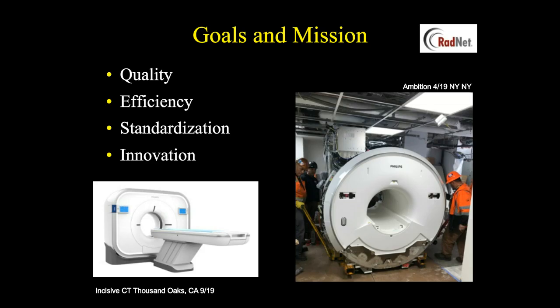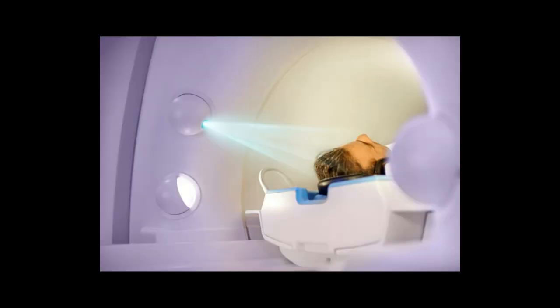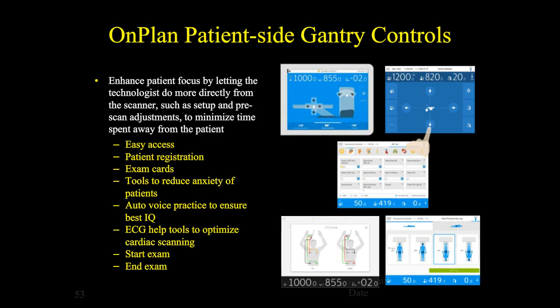So, for the rest of the half hour that we have between us, I would like to spend some time talking about some of the efficiency tools that come into play on both the CT and the MRs that we have installed in our institution. One of the biggest, most powerful tools are tools that are dedicated to automatic scanning and enhanced workflow. Whether it is automatic detection of cardiac rhythm and respiratory rate, so we don't have to put on bellows, or staying at the scanner and being able to control virtually every individual piece from the scanner console, so I don't have to go in and out of the room a lot, or even operating totally within the room.